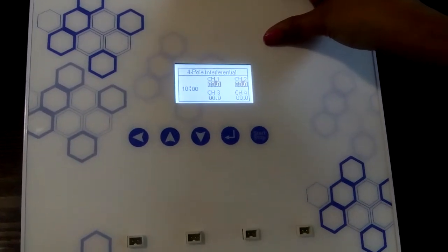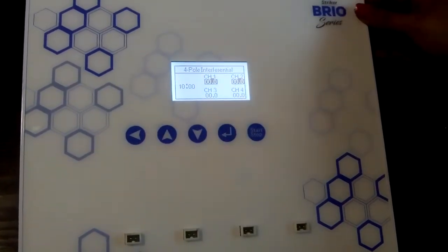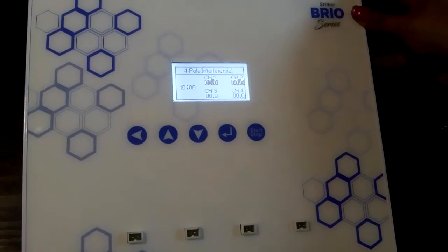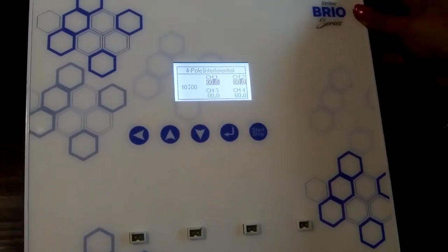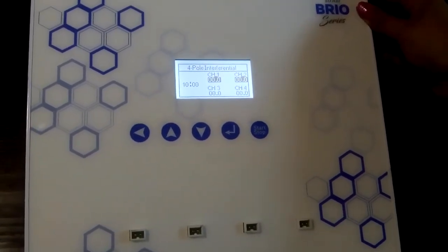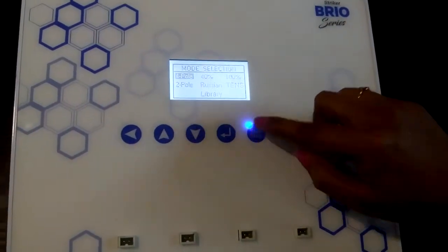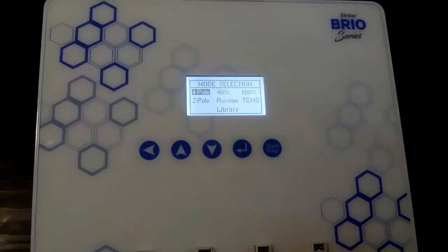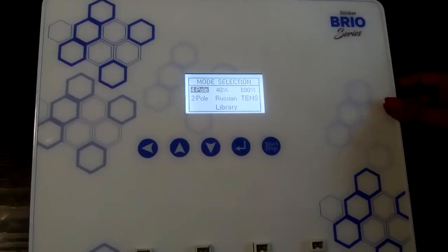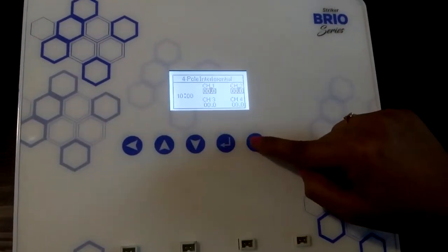The machine also has the facility to increase all 4 channels together. To do that, we have to come out of the 4-pole mode by pressing the stop button.